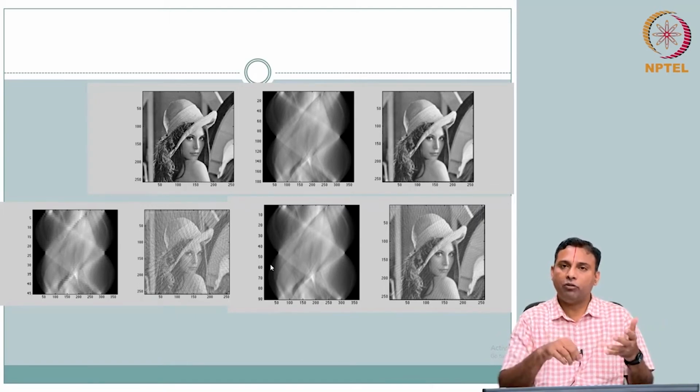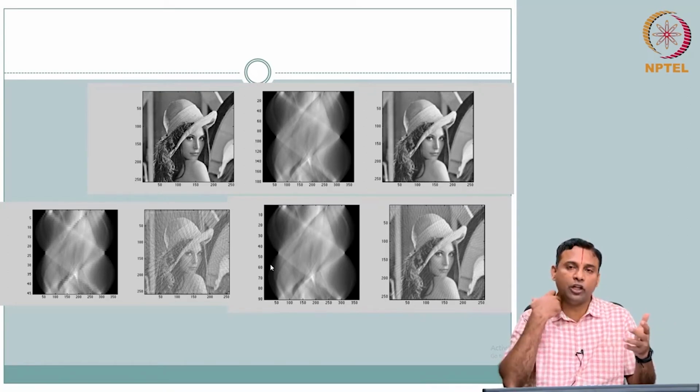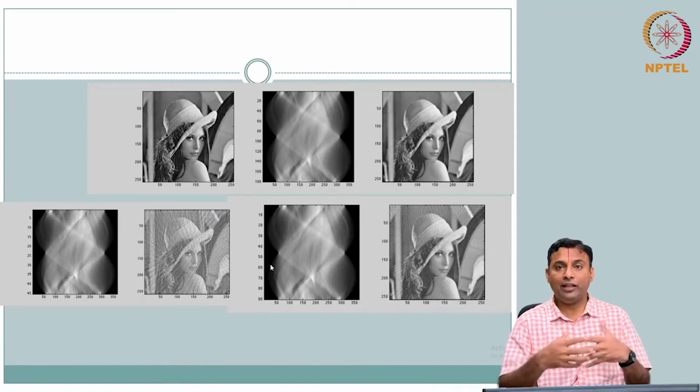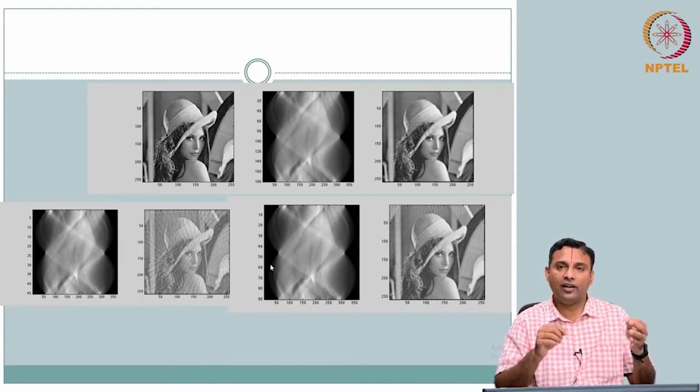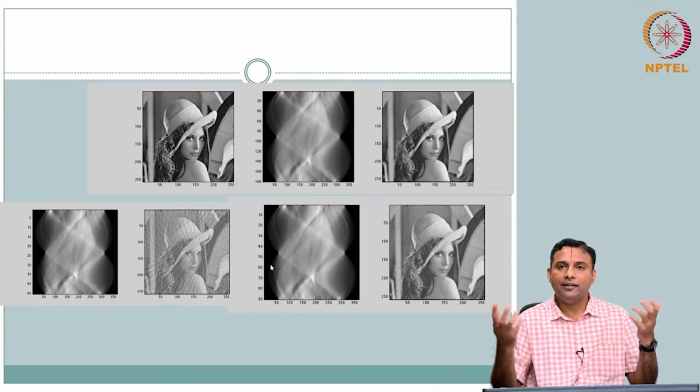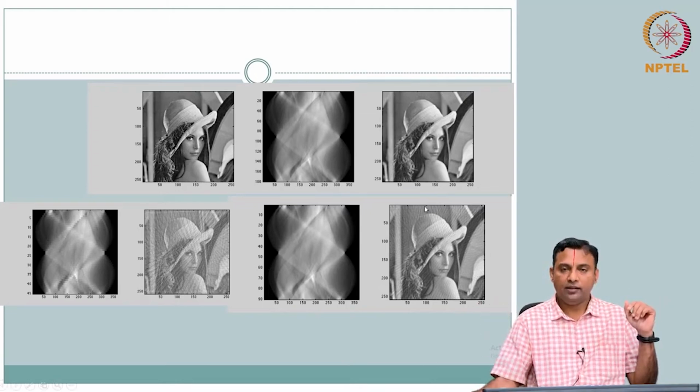Simple back projection of a square, a cube, right, which we did. You can try different geometries which are easy to get a feel for. But if you have a real object, to project that, you cannot use paper and pencil and calculate, right? It will be tedious. So you cannot say, no, I don't have X-ray raw data and therefore I cannot work on it. That couldn't be an excuse here.